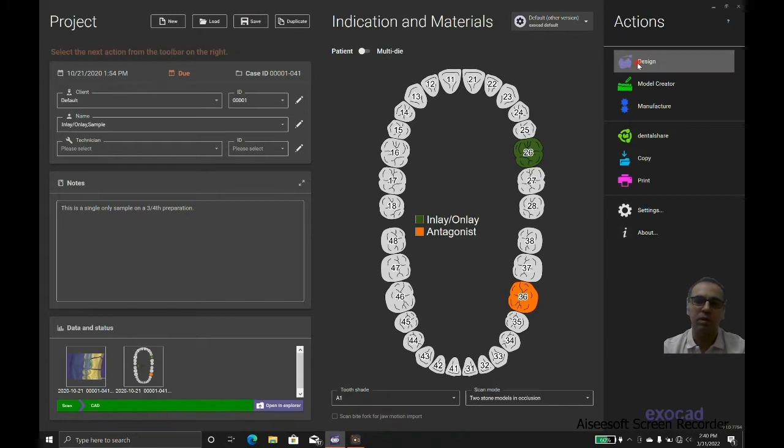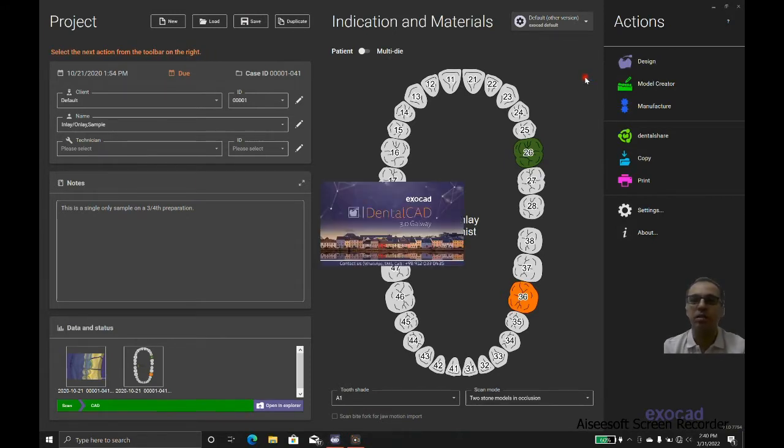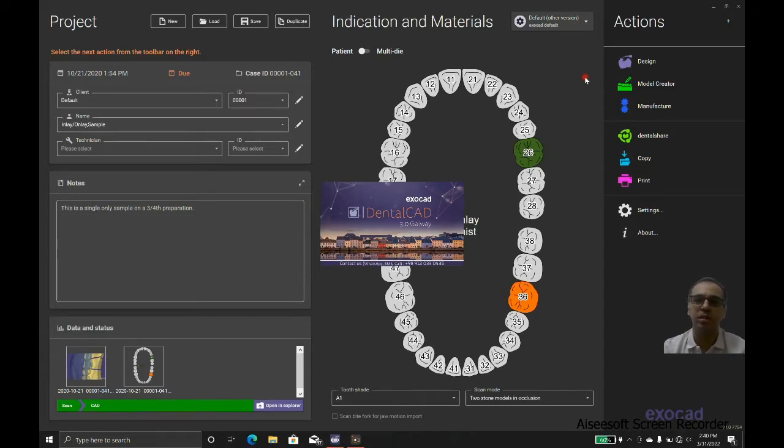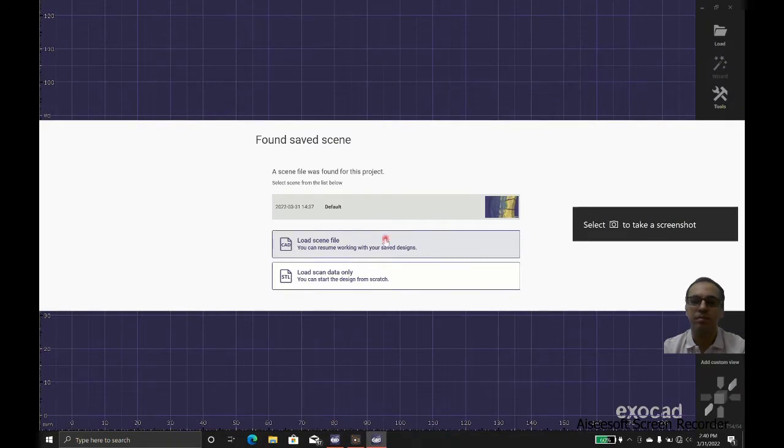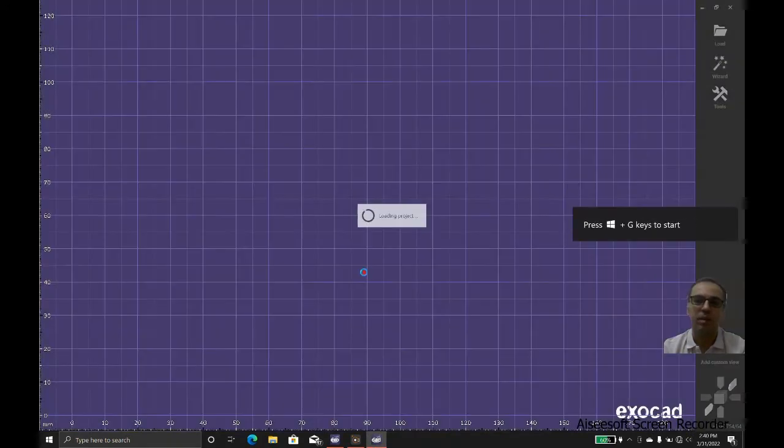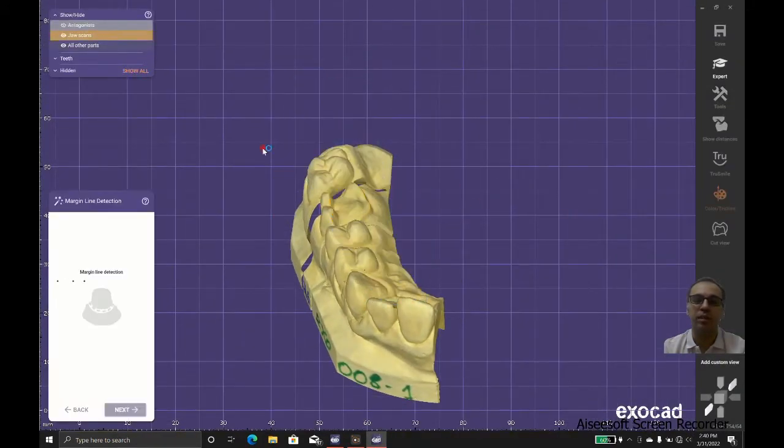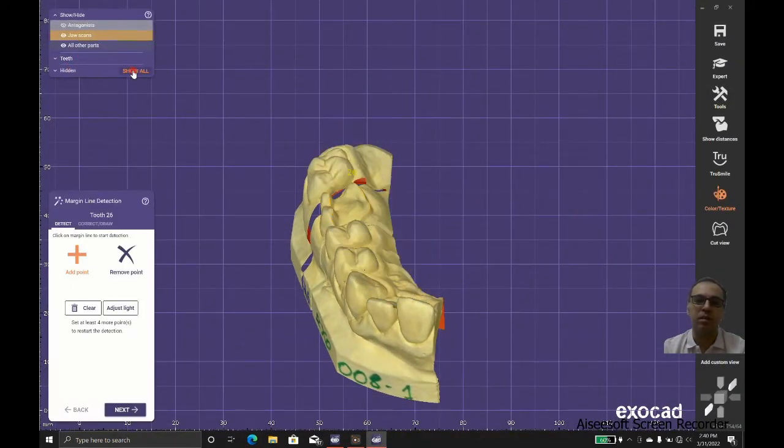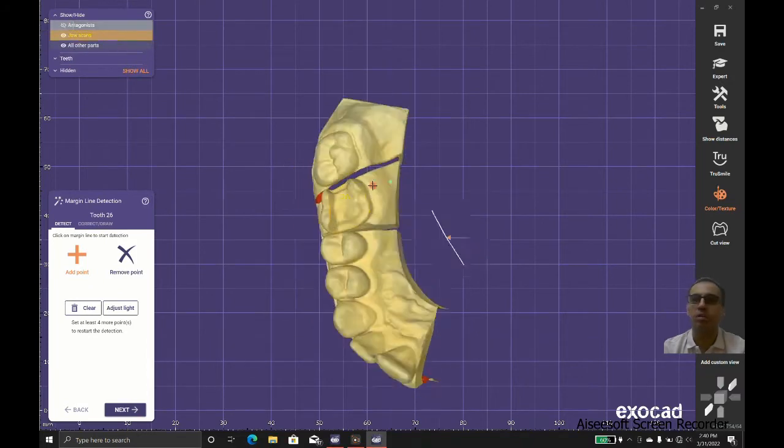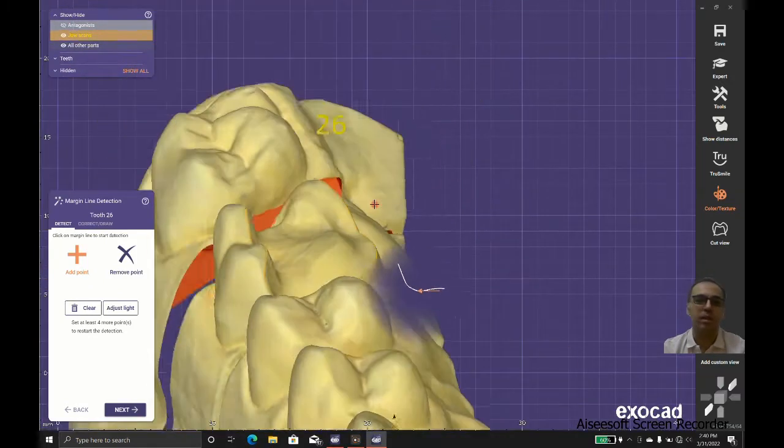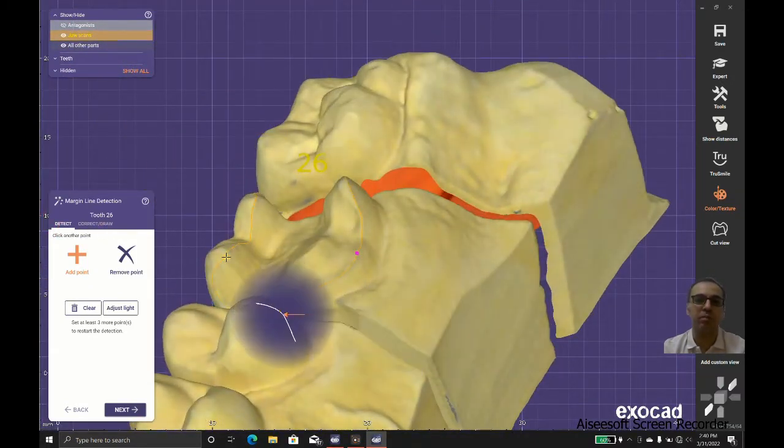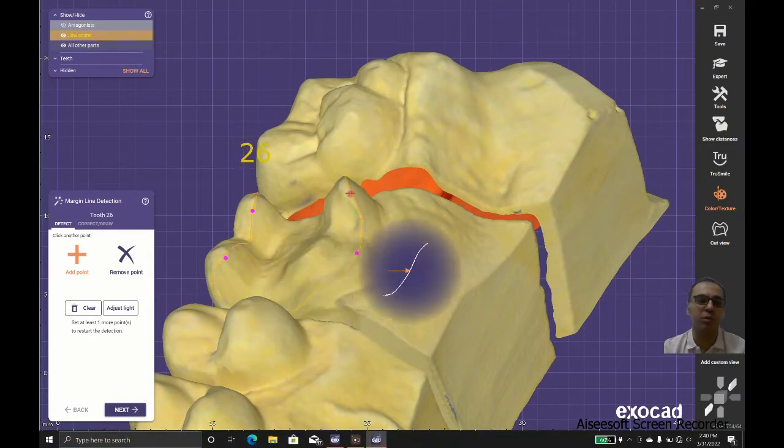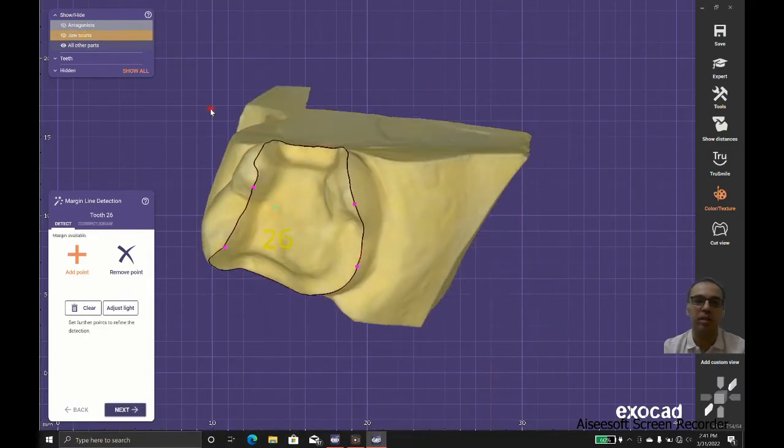Now we're going to design the part. We need to use the scans that come from the scanner or insert the STL data we have downloaded. We can detect the margins with four points and the artificial intelligence does the job very well, or we could do it point by point with the magnet tool.